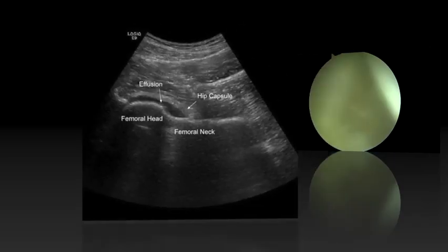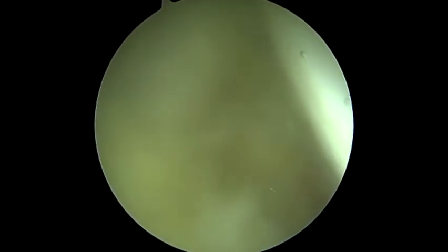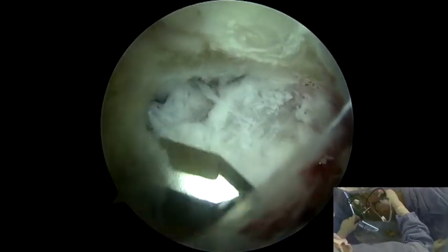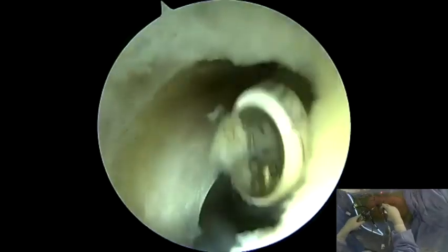After initial access to the hip was obtained from the anterolateral portal, grossly purulent fluid was observed, and a limited lavage was needed to establish the mid-anterior portal under direct visualization. Both portals were achieved with periportal capsulotomies, without completion of a full interportal capsulotomy, to preserve capsular integrity.